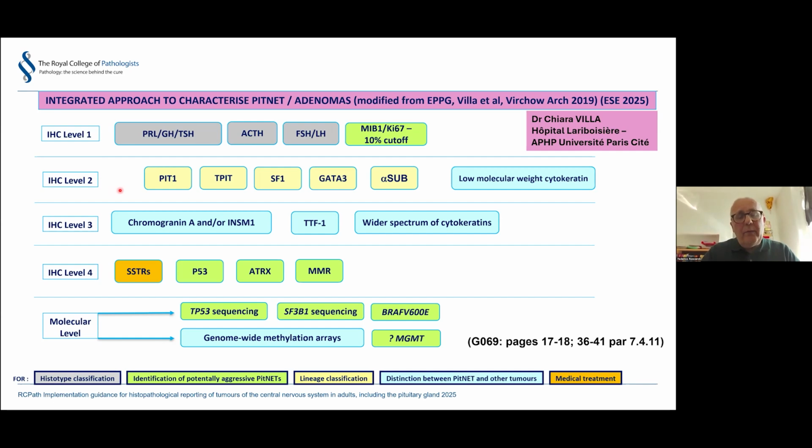If we confirm it's a primary pituitary tumor and is immunonegative, then one step for the classification is using methylation arrays. Pretty much all the cases that do not stain for transcription factors or hormones come back as a gonadotroph or corticotroph identity. So null cell tumors effectively don't exist. If there are questions about it being a primary tumor of adenohypophysial cells, then we treat the biopsy as any surgical pathology specimen. So we broaden the panel of antibodies. TTF1 will be the first option, and then cytokeratins, and then everything that helps define the tumor.